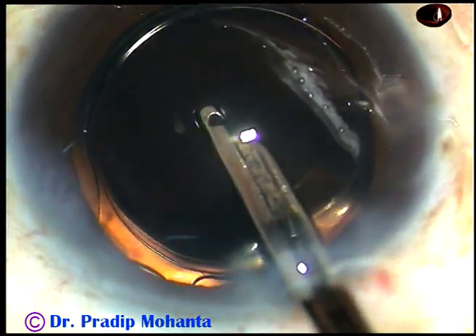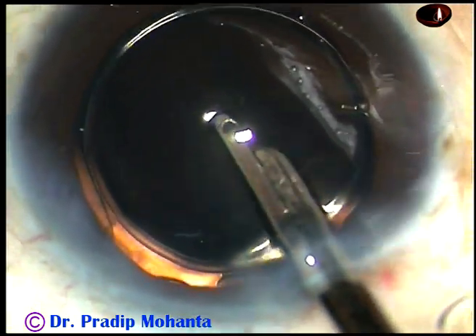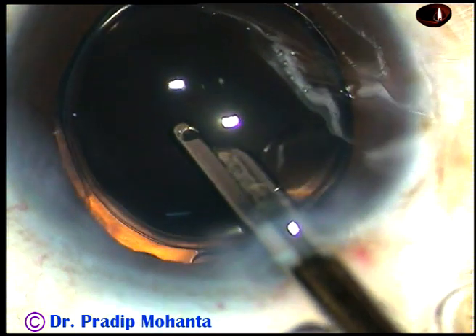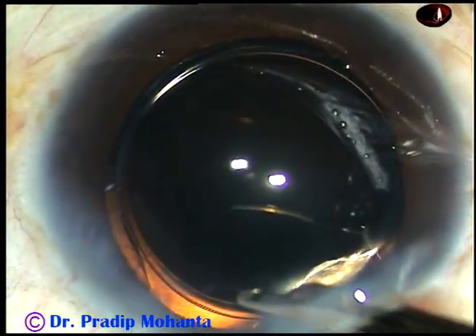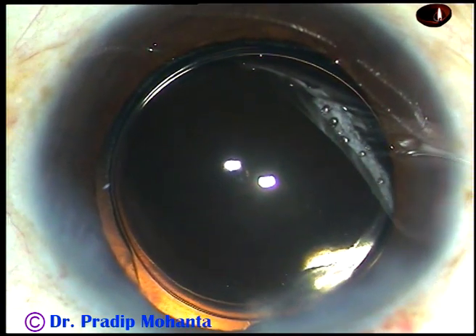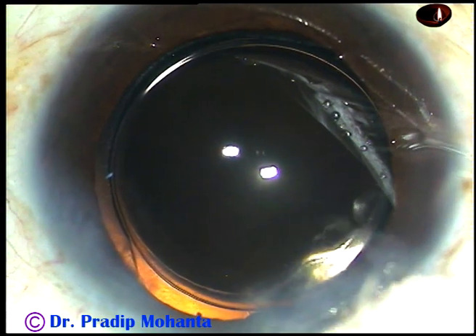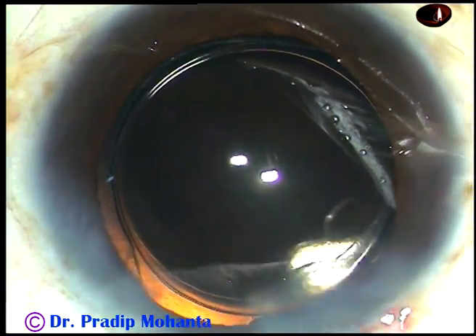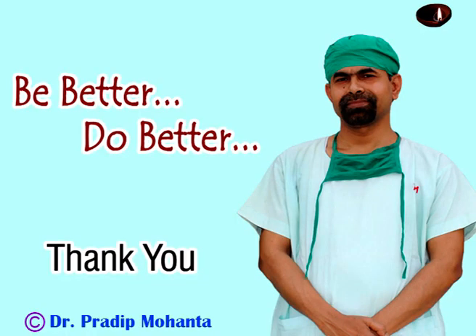And now we are towards the end of the surgery. This is a totally unedited surgery and you can think that you have watched a live surgery. The anterior chamber is formed and then you test the wounds — there should not be any leakage from any site. That's it. Thank you very much for watching. Hope this video will help you in developing your surgical skills. Be better and do better.